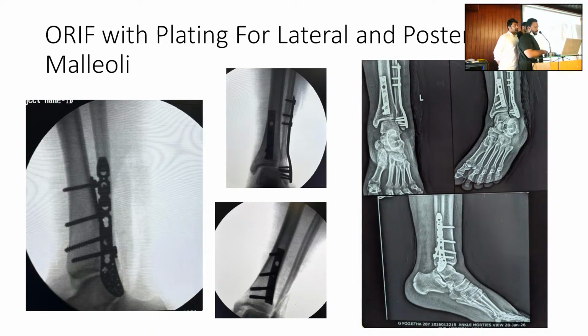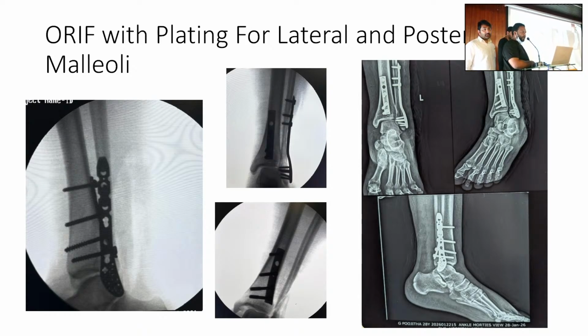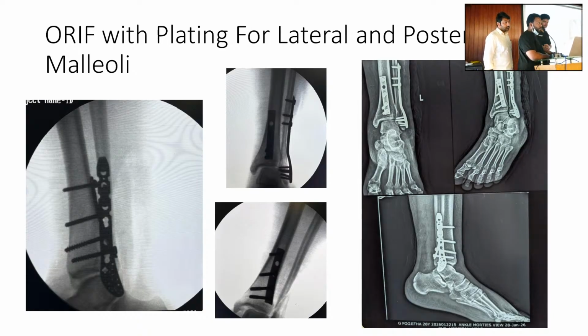Yes, sir. Posterior, they are fixed. Sir, for posterior malleolus, we have used a 1/3 tubular plate, sir. 5-hole 1/3 tubular plate. And for lateral malleolus, we have used a locking plate, sir. Not recon, sir. Locking plate. Pre-contoured locking plate, sir. Right. No, sir.